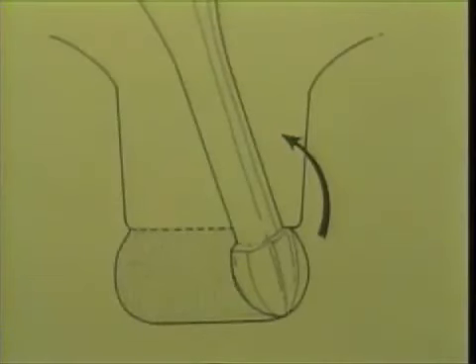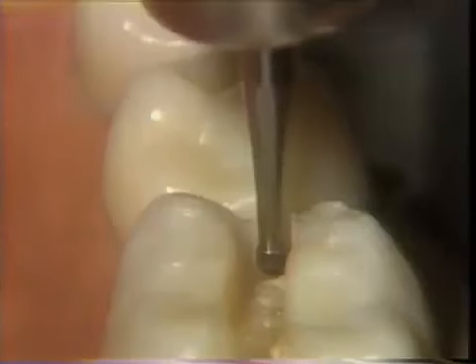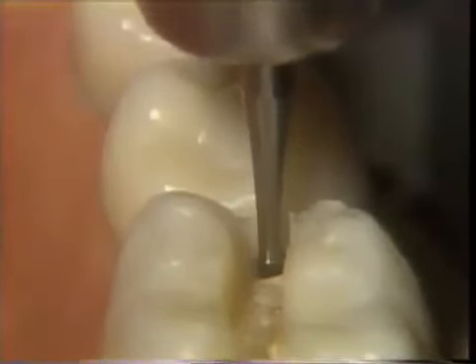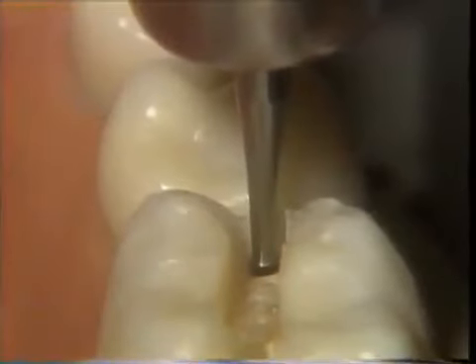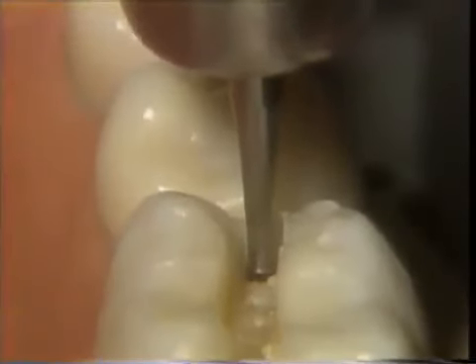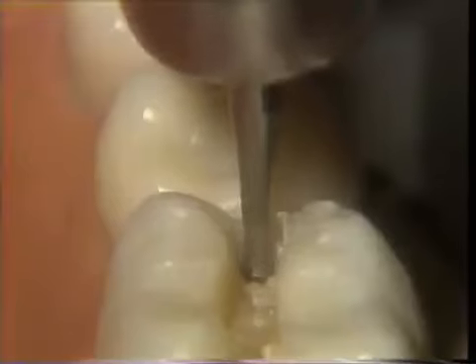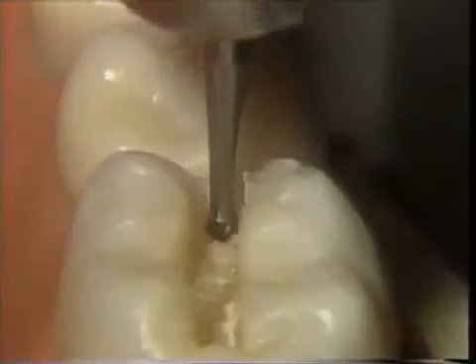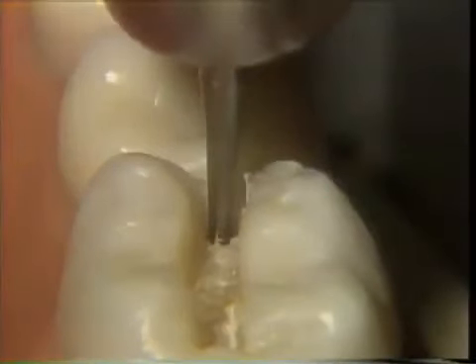The diagrammatic example will now be demonstrated on the extracted tooth. The dento-enamel junction is identified and penetration of the burr 1/4 in dentin and 3/4 enamel is begun. As mentioned before in the diagrammatic example, 3 or 4 strokings of the burr toward the cervical usually results in the burr penetrating to 1/4 millimeter beyond its cutting area. To check the depth, the burr is withdrawn, the handpiece is stopped, and the burr placed into the prepared tooth.